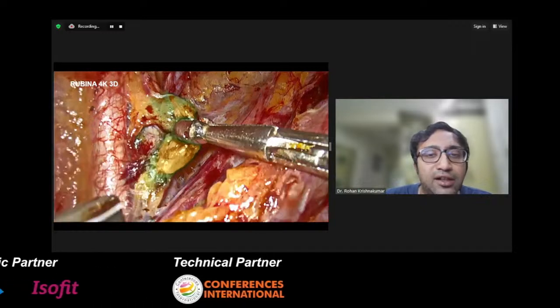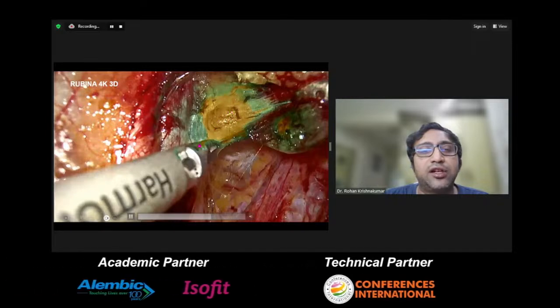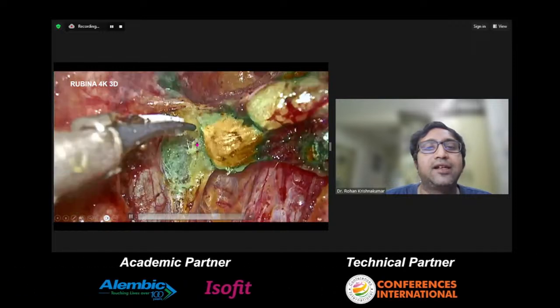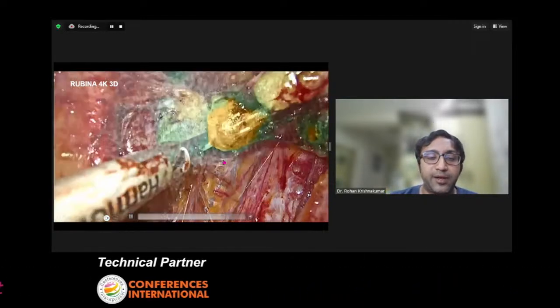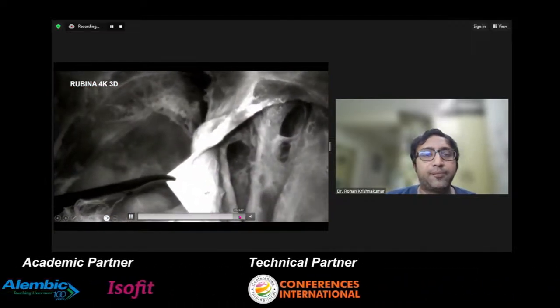Plus here you can further see these orange color appearances, which also indicate where the dye is concentrated more. So these modes are available in the new system, and it is very important to know them so that you're not missing the area where the dye is at maximum, because that's the first place the tumor would have spread and you want to biopsy these areas. Apart from that, overlay and these other things are also available.